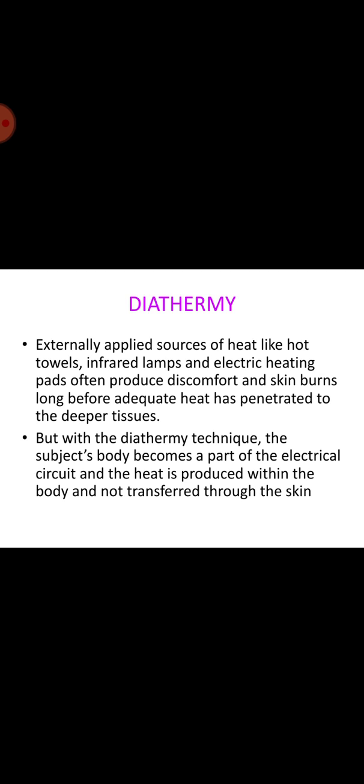Electrosurgical coagulation of tissue is caused by the high frequency current flowing through the tissue and heating it locally so that it coagulates from inside. The coagulation process is accompanied by grayish-white discoloration of the tissue at the edge of the electrode. The term fulguration refers to superficial tissue destruction without affecting deep-seated tissues.